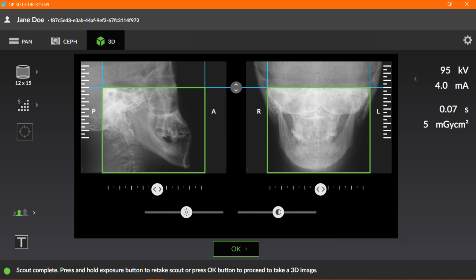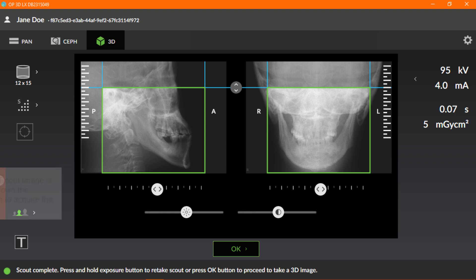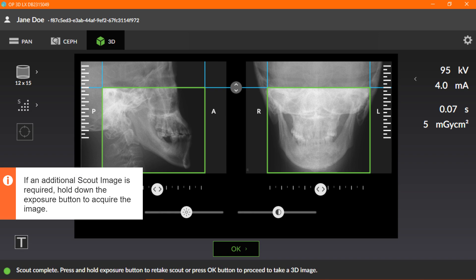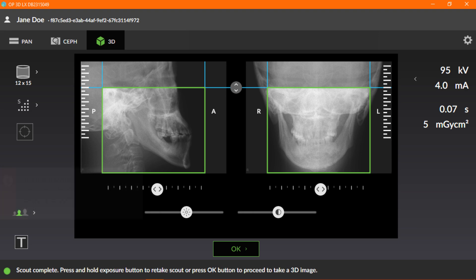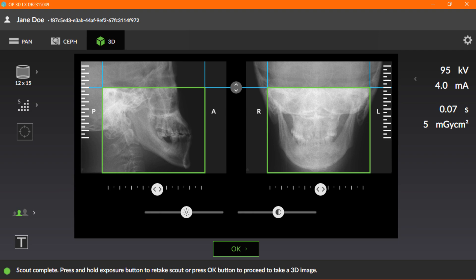Once you've made your adjustments to the scout image, click the OK button to approve the changes made to the field of view location and size, and to proceed to capturing your 3D image. If an additional scout image is required, simply hold down the exposure button to acquire the new image. Now that we've described how to prepare and capture a scout image, let's move on to the next section.